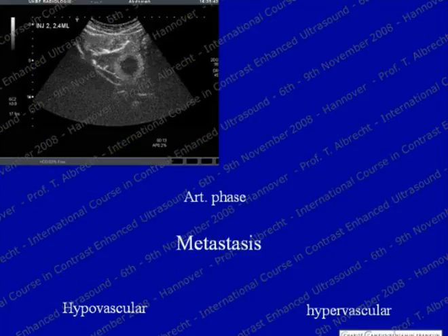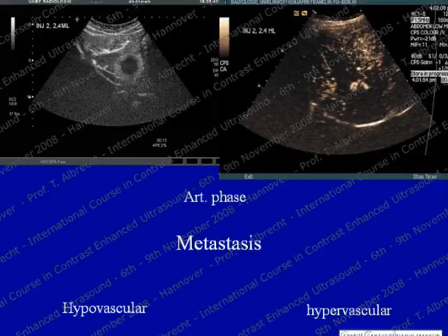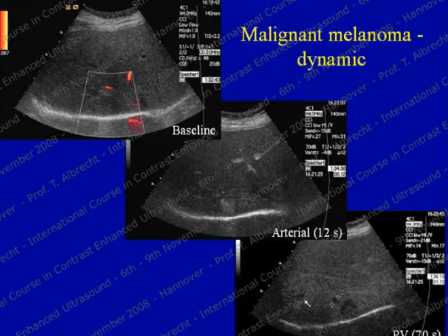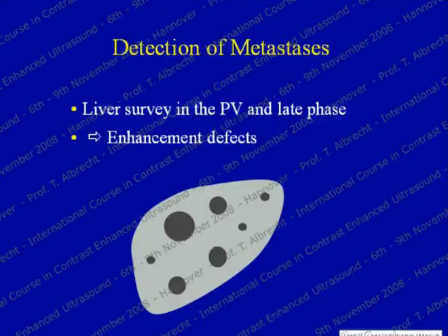Here is a very typical hypovascular metastasis with a nice rim enhancement in the arterial phase. And here is the equivalent arterial phase imaging of a hypervascular metastasis. Here are the delayed phase images. You can see that the appearances in the delayed phase are really pretty much identical, independent of what they look like in the arterial phase. Here is another hypervascular metastasis from a malignant melanoma showing the enhancement defect, and also two non-enhancing lesions which represent further metastases that were invisible on the baseline scan.